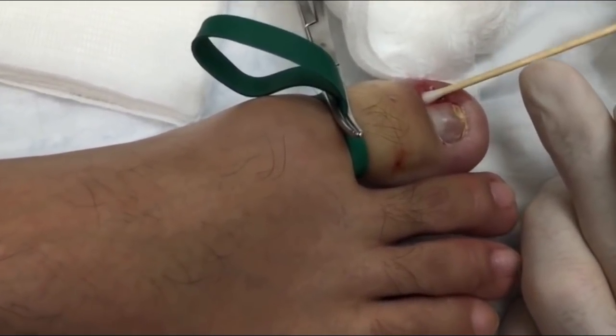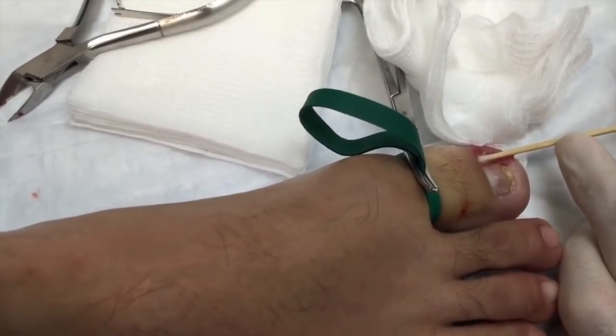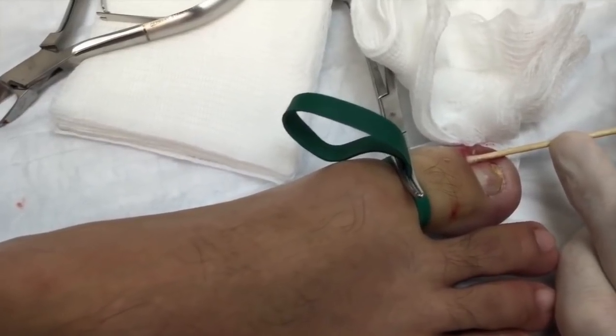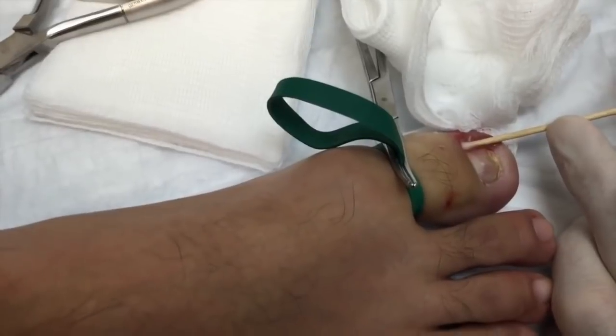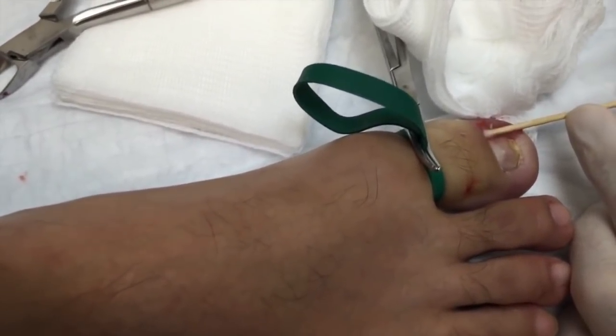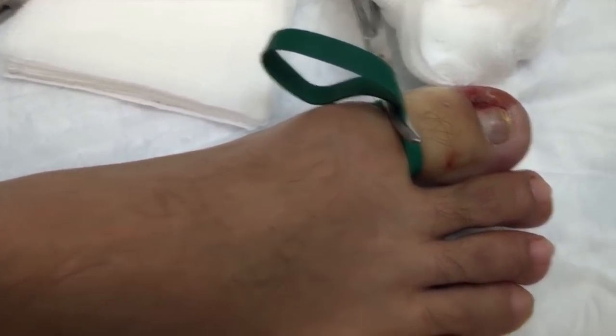So kind of, but it's not still going to grow normal, right? Well, the rest of the nail will. So what does that prevent? For the nail to grow as an ingrown? Right, just prevents the very edge of the nail from growing in. And I need to do that. Do you? Can I videotape? No, because it would have too much fun.